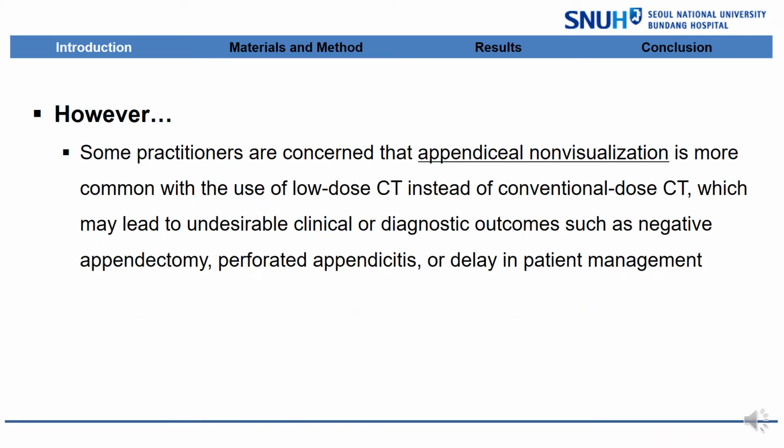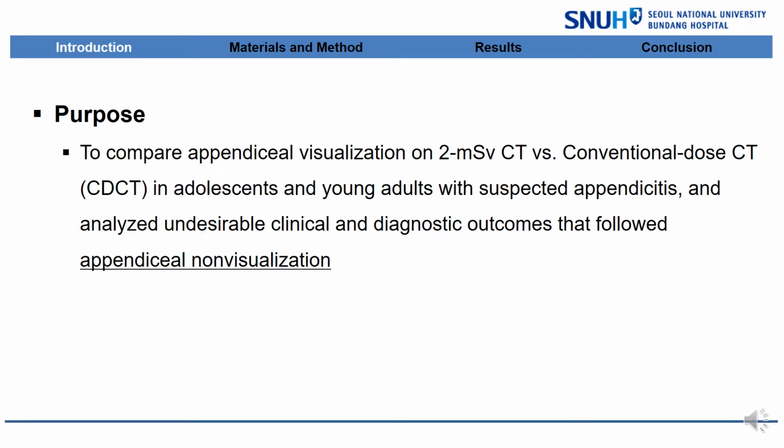However, some practitioners are concerned that appendiceal non-visualization is more common with the use of low-dose CT instead of conventional dose CT, which may lead to undesirable clinical or diagnostic outcomes such as negative appendectomy, perforated appendicitis, or delay in patient's management. So the purpose of this study was to compare appendiceal visualization on 2 millisievert CT versus conventional dose CT in patients with suspected appendicitis, and to analyze undesirable clinical and diagnostic outcomes that followed appendiceal non-visualization.